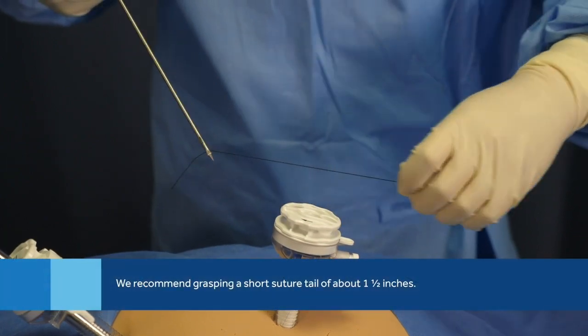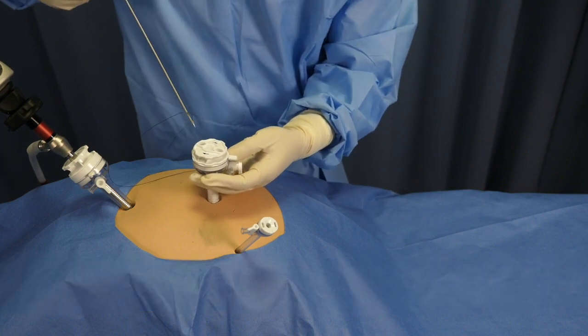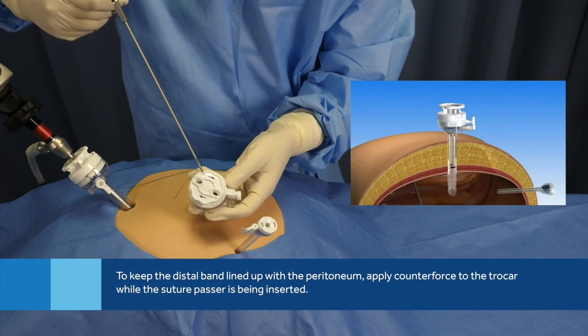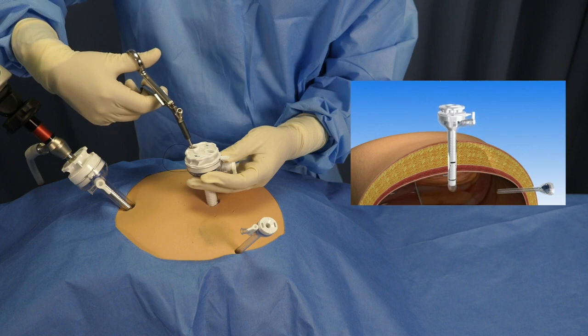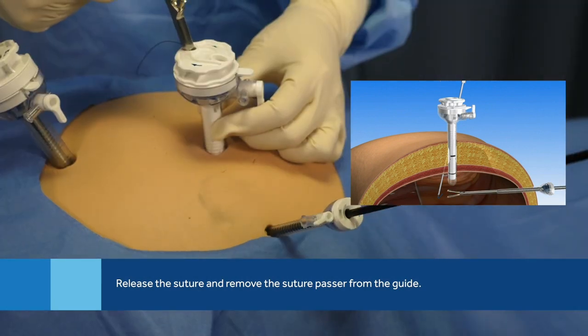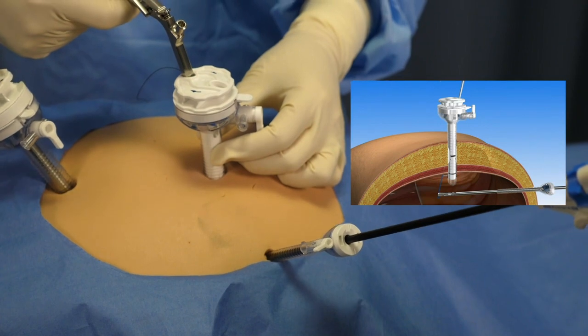Open the jaws of the suture passer by extending the pointer and thumb rings. Grasp a short tail of suture from the end of the suture with the suture passer. Insert the suture passer down either one of the two guide channels and advance the suture passer through the tissue and into the abdominal cavity. Release the suture.